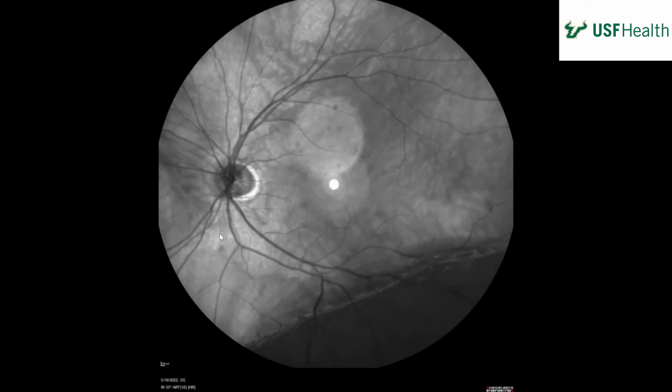Looking at the vessels, I don't see any notable changes in reflectance. Then, drawing attention again to the inferior temporal periphery, we see hyporeflectance distal to this whole linear change here. And those white spots would be hyperreflectant. Show the people that line there, that little edge between the dark and the light. Can you put your mouse on that? That's on the IR. Sometimes you can pick up these little edges, which are nice to follow later. That's one of the reasons I got the eye. Sometimes they don't show up, but sometimes they do.